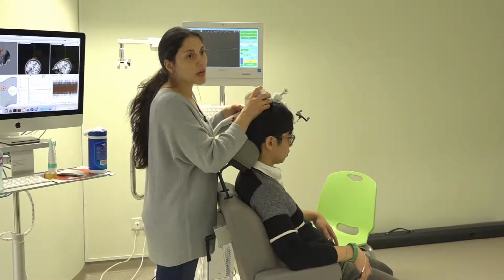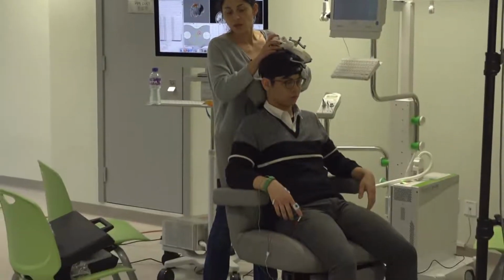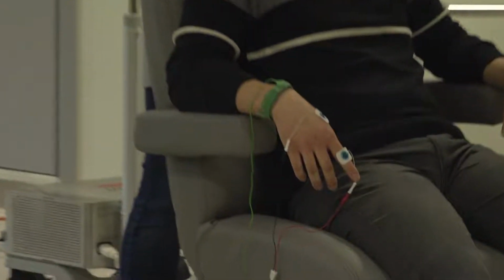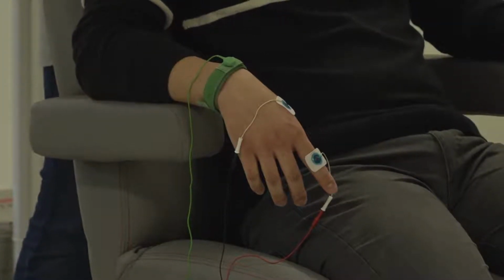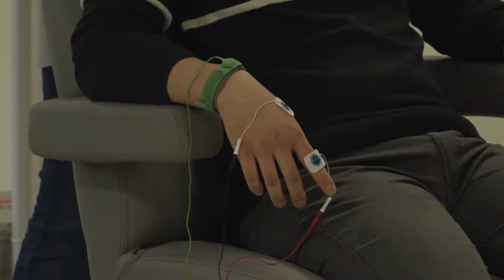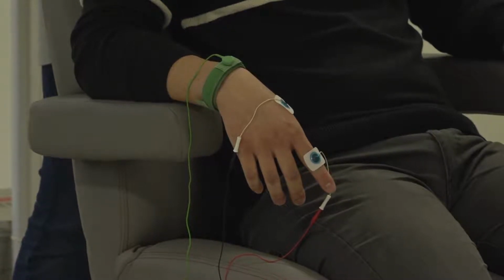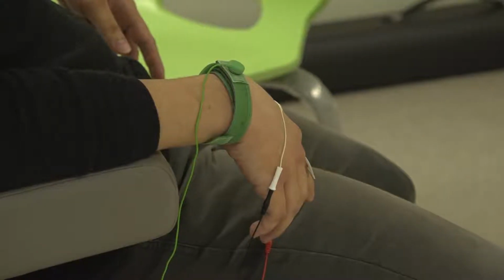So for me, that would be a good spot, right? You see the twitching? And it's practically only that, which is very clear. So that will be the spot I will select as a hotspot, for example, right? It's highly reproducible. So that will be my hotspot. Do you see? I think it was quite a good example.